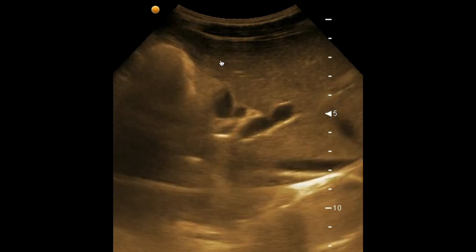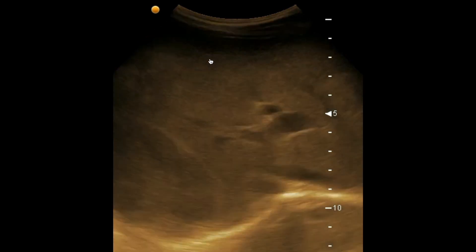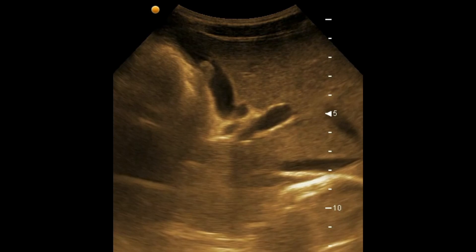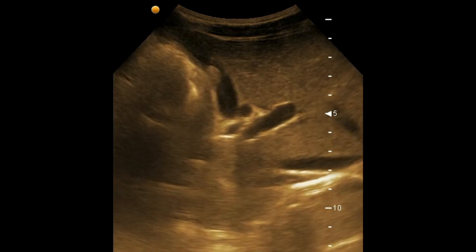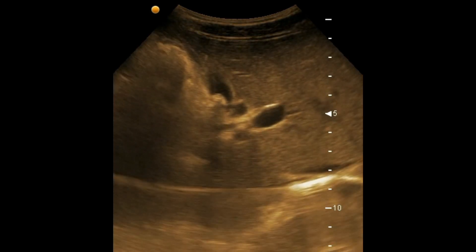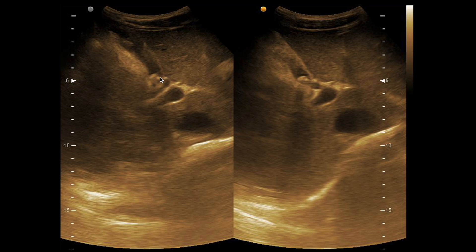Here's the area for the comet tail artifact. Here's the picture of the gallbladder and you can see the stone here at the neck region right now, and it is casting acoustic shadow on the right image. And this is the site for the adenomyomatosis where you have seen the comet tail artifact.